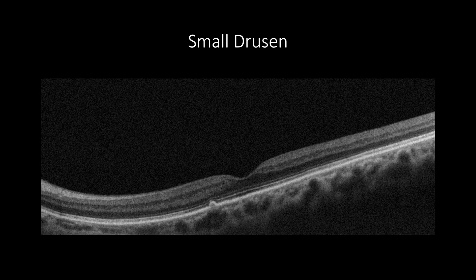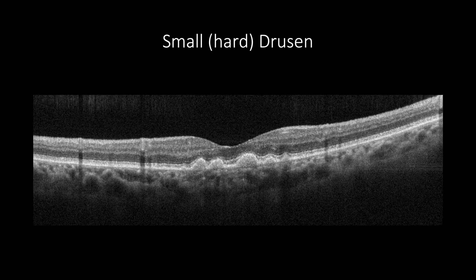Small drusen size is less than 63 microns, and when there are only a few of them, the case is not accounted for as age-related macular degeneration. Small drusen are called hard drusen. They usually appear as a small elevation of the RPE with hyperreflective content, without any disruption of the ellipsoid zone or external limiting membrane. However, increased hyperreflectivity adjacent to the drusen is an alteration of the Henle fiber layer and should not be mistaken with intraretinal pigmentation.